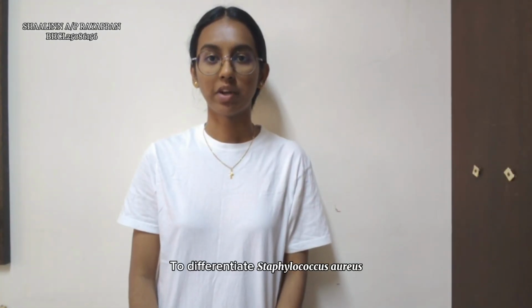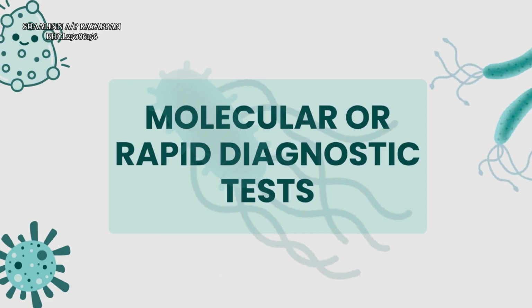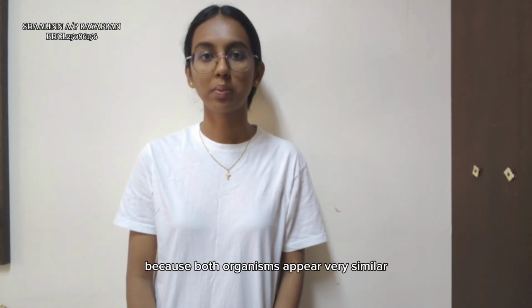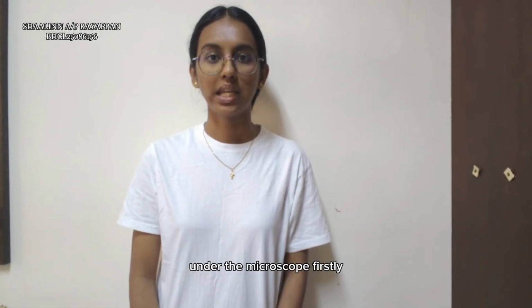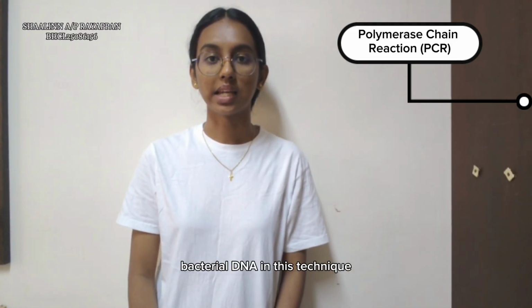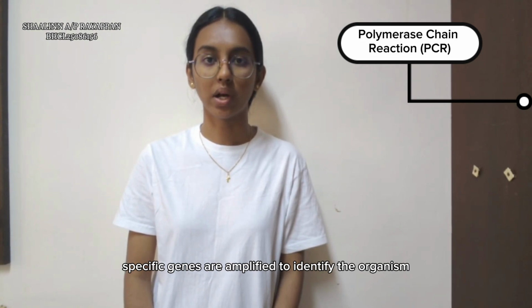To differentiate Staphylococcus aureus and Staphylococcus epidermidis, molecular and rapid diagnostic methods such as PCR, multiplex PCR, and latex agglutination tests are commonly used, because both organisms appear very similar under the microscope. Firstly, polymerase chain reaction, PCR, is a highly specific molecular method that detects bacterial DNA. In this technique, species-specific genes are amplified to identify the organism.